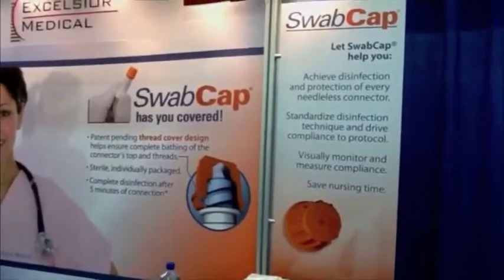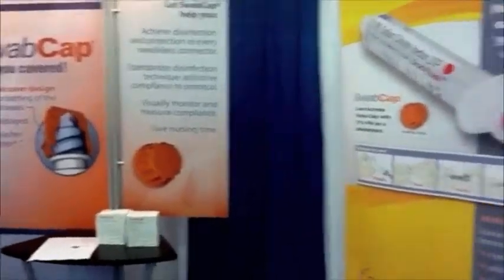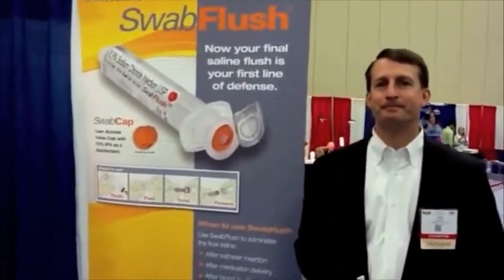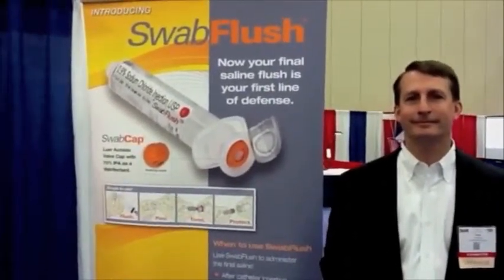Also new from Excelsior Medical is Swab Flush. With us today is Tony Sia, Vice President of Global Marketing for Excelsior Medical. He's going to talk to us for a moment about Swab Flush and the combination product of a flush syringe and a disinfection cap. Tony, tell us about Swab Flush.